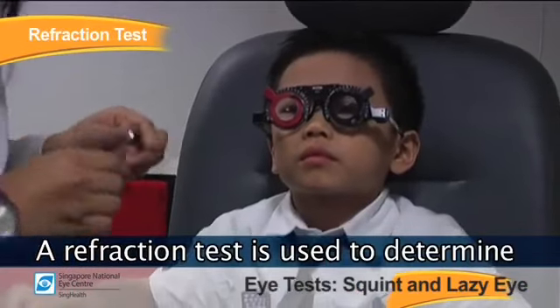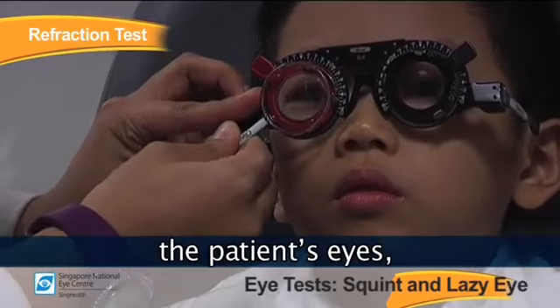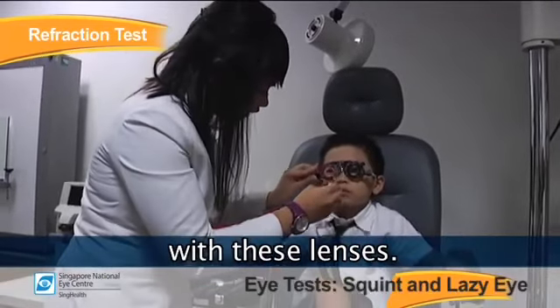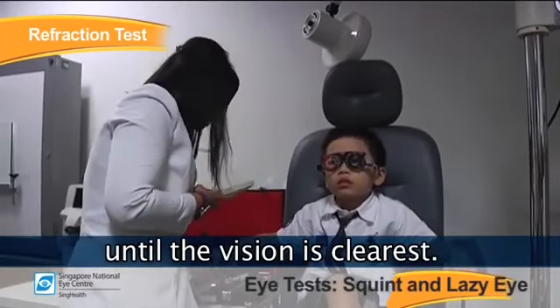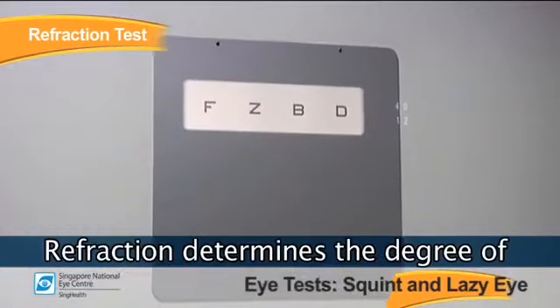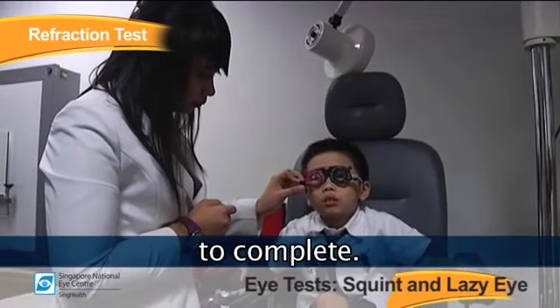A refraction test is used to determine the spectacle power. During refraction, an optometrist puts an instrument called a trial frame in front of the patient's eyes, together with a series of lenses of various powers. The patient's vision is then tested with these lenses. The optometrist will continue to fine-tune the lens power until the vision is clearest. The lenses with which this level of vision is achieved is the spectacle power of the eye. Refraction determines the degree of farsightedness, short-sightedness, and astigmatism. The test takes about 10 to 20 minutes to complete.